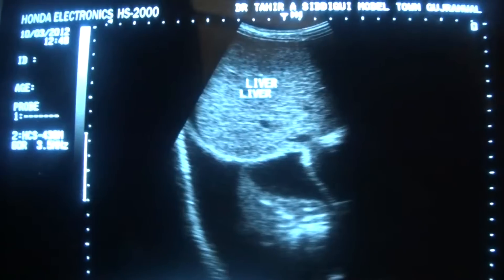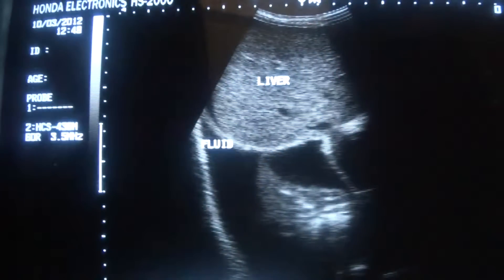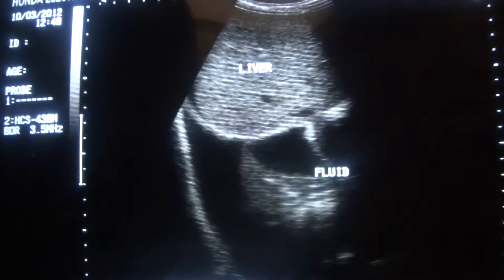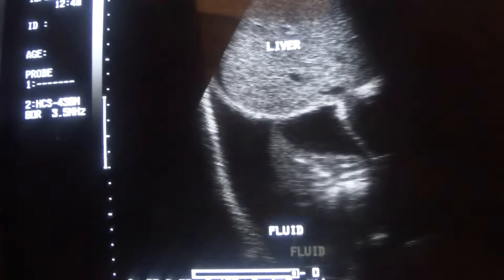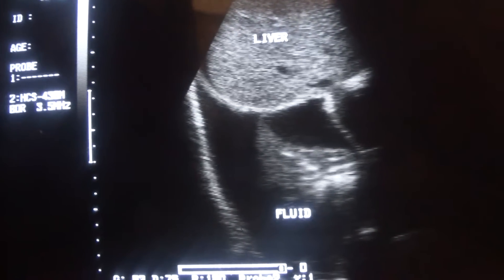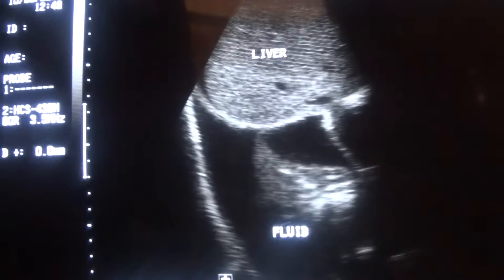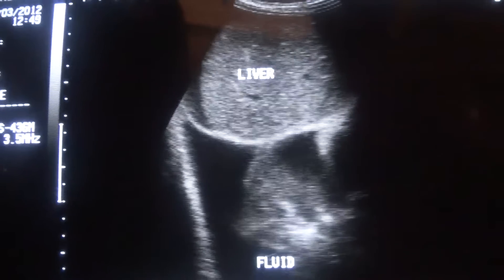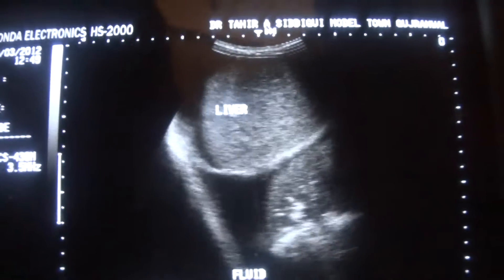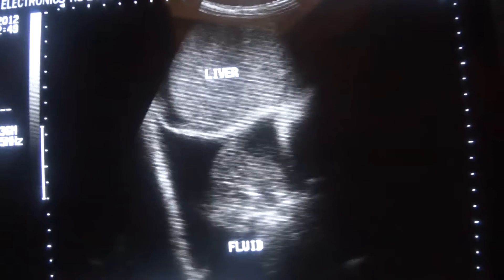This is the liver, this is the fluid — the black area you are seeing is the fluid, and it is in the fluid cavity. This echogenic area you are seeing within the fluid is in fact lung tissue floating in the fluid.